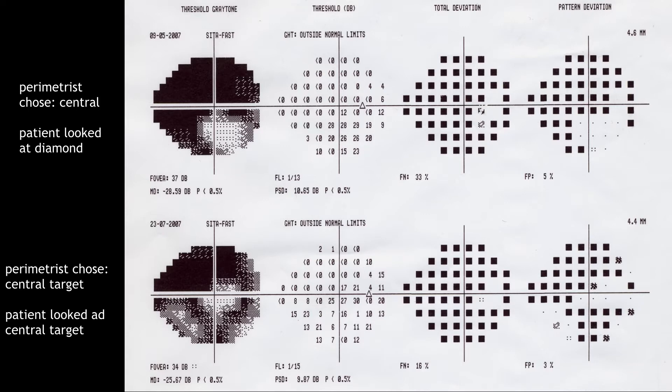This is an overview printed at the top part. We have an island located at the bottom part of the visual field, which is not typical in patients with advanced glaucoma. After repeating the test we have the typical central island. The perimetrist first chose the central fixation target but the patient looked at the diamond; when the test was repeated the perimetrist chose central and the patient looked at the central target.